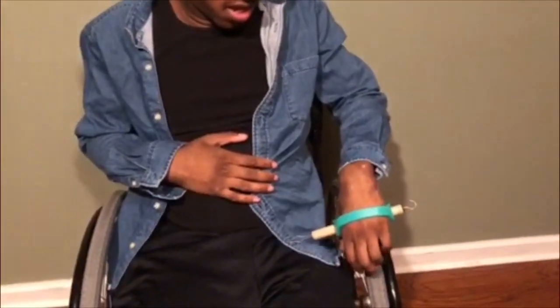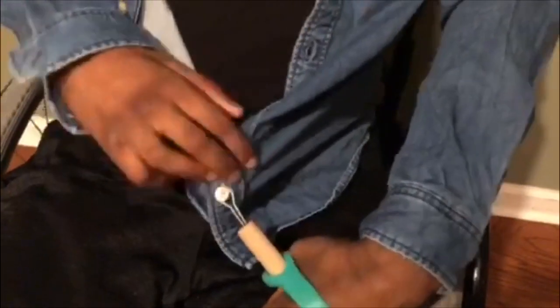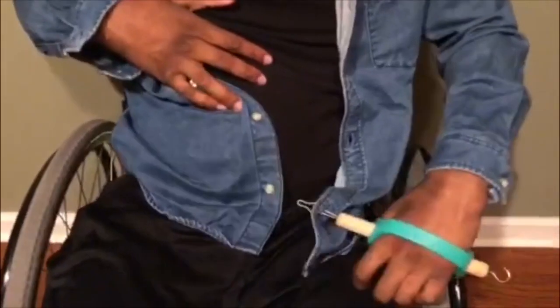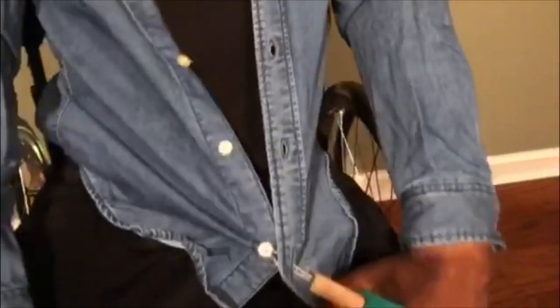First, I put the hook in the spot of the button, right there. Then you're going to want to put it over like that. We're going to try it again — as long as you get it hooked on there. Now it's hooked on.